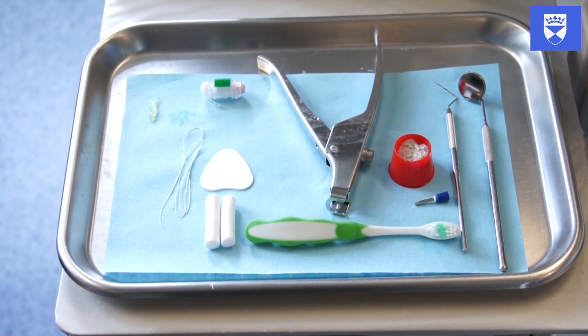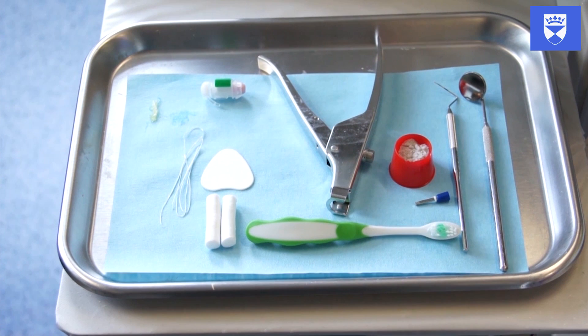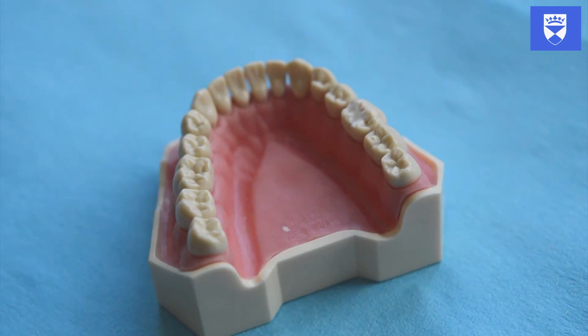This video demonstrates a predictable and reliable method of placing a glass ionomer fissure sealant. On the screen you can see a selection of materials and instruments that you may find useful in undertaking this procedure.